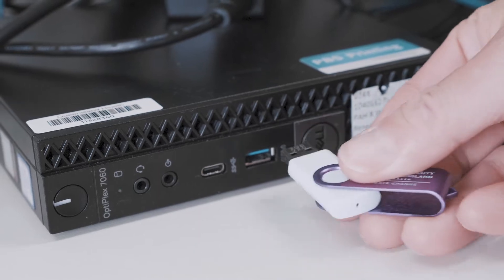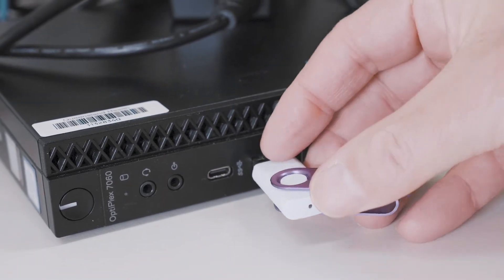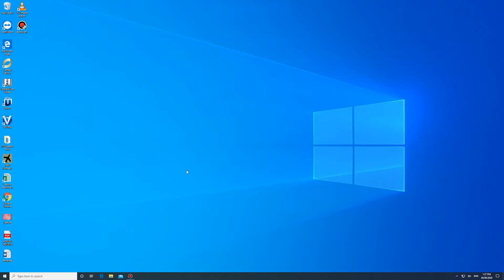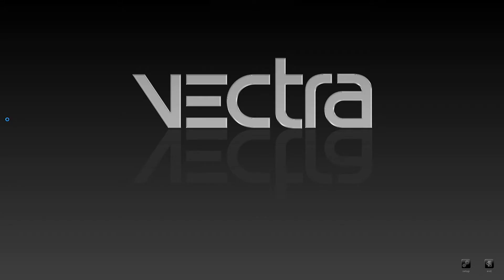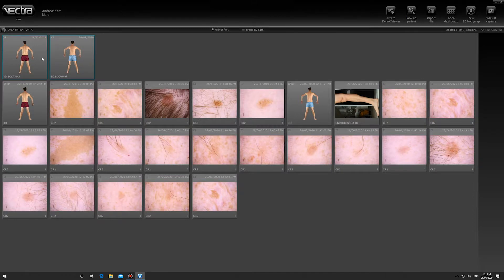To start the examination, insert the USB stick and double click DermX Viewer software, or the other software depending on what system your patient has had their photos taken. This will open the patient file dashboard where you will be able to see the body map thumbnail and additional 2D views of the patient.